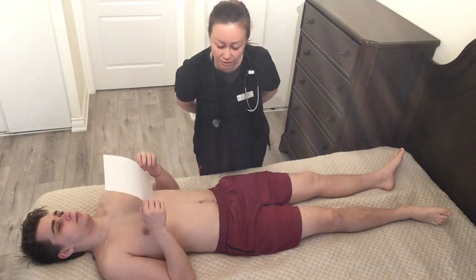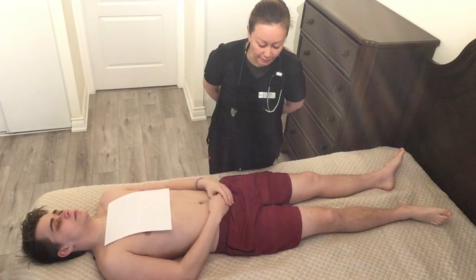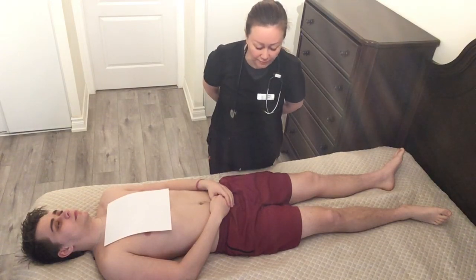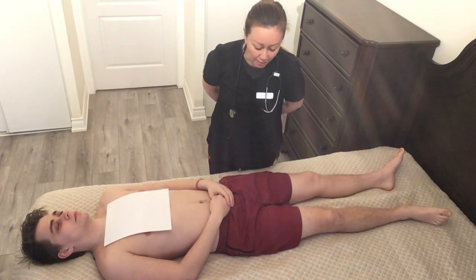You have hypertension today. Blood pressure is 167/100. Respiration is 20 breaths per minute. It's a normal range but high border. You have tachycardia at 105 beats per minute, probably due to the pain. Temperature is 37 Celsius. It's a normal range.